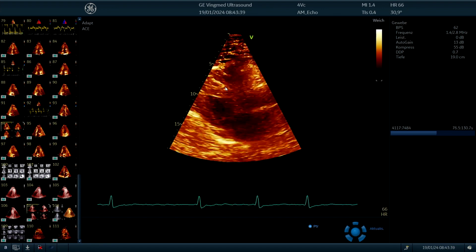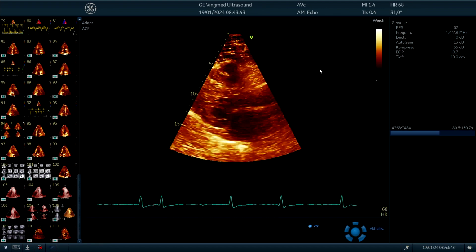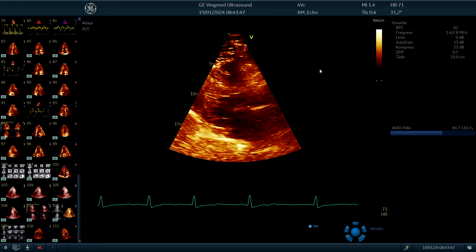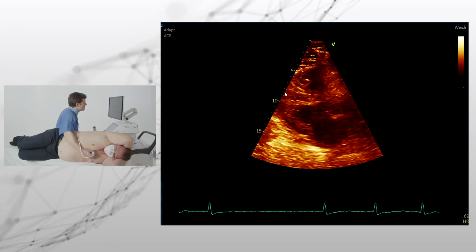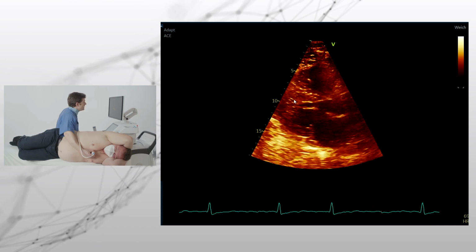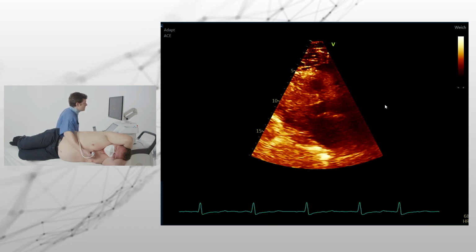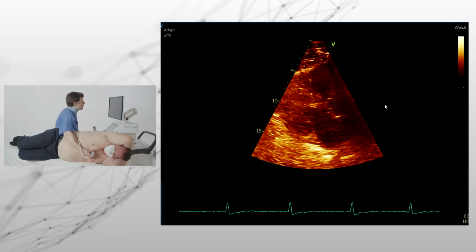So this, of course, can be hypertrophy, but we have to differentiate if there could be another cause, for example, arterial hypertension present. In this case, the interventricular septum easily exceeds 15 millimeters. You see here 2 centimeters. It must be around 20 millimeters. So it's definitely severely thickened. Therefore, it's unlikely that this is only due to hypertension.